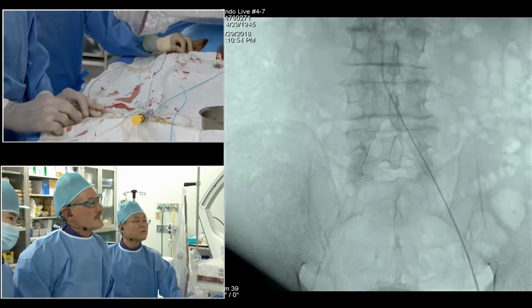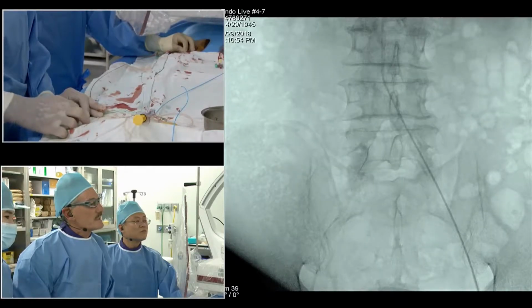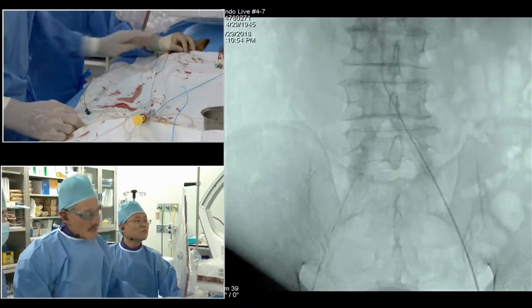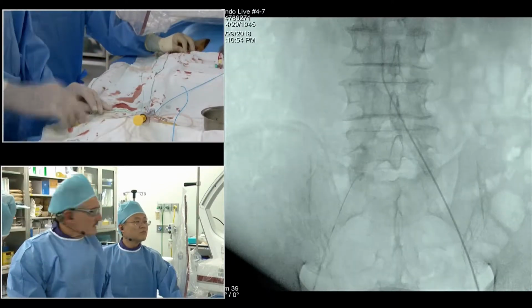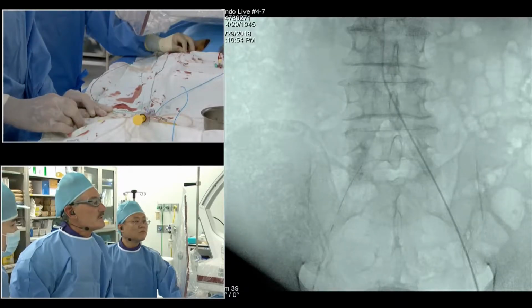Yeah, I would agree. This has been deviating repeatedly. So what do we have here in the laboratory for up and over access? Do you have a tightly curved guide? I think an IMA guide might be the one thing you have.